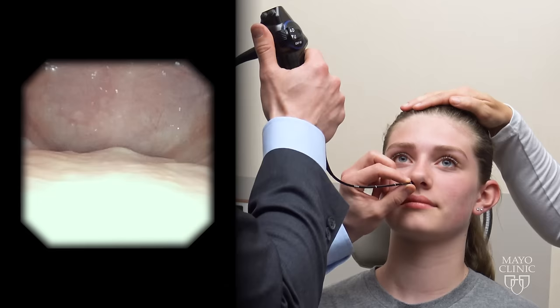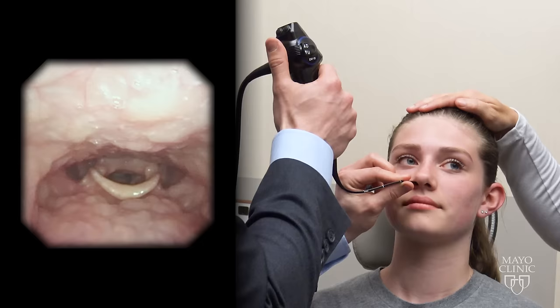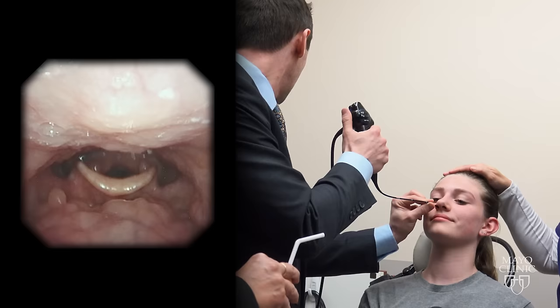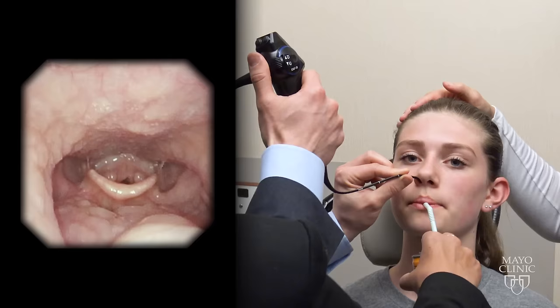That's the absolute worst part right there. Can you see? If you're busy on the TV or if you want, we can show you afterwards. Ready for me?